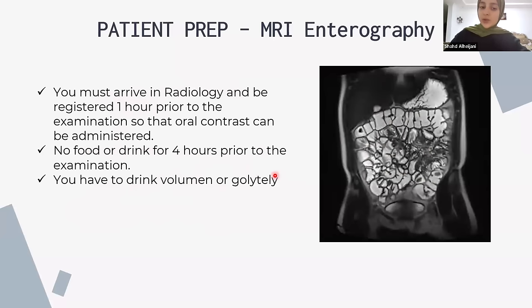So why do we do this? Again, so we want to clear the bowel. When we empty the bowel, it will be easier to scan to see any abnormalities. If there is any diverticulum, any tumor, any stricture, anything going on, it won't be easy to visualize if the bowel is full.